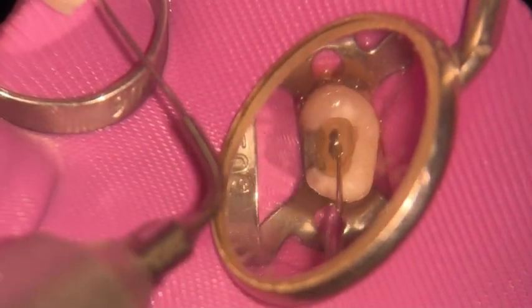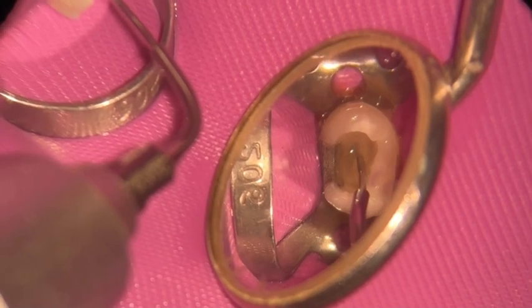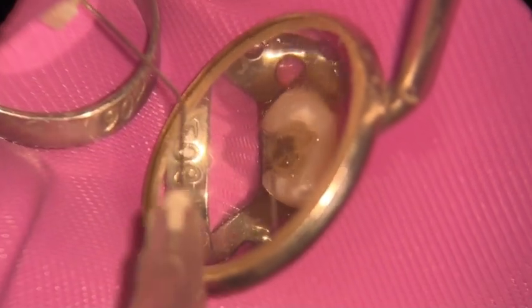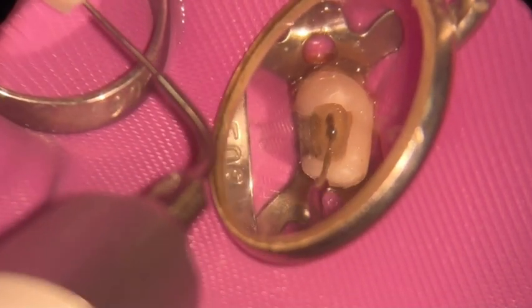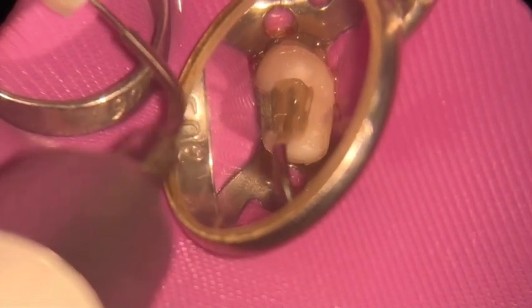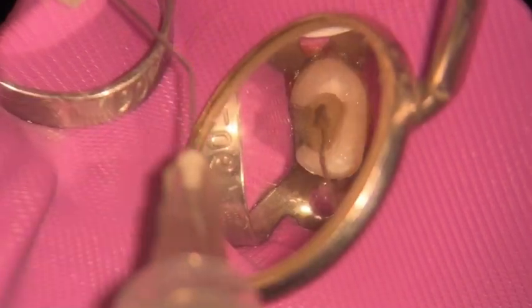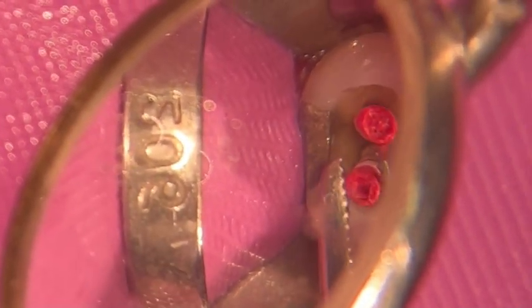We're going to do some ultrasonic activation now. Just be very, very careful with ultrasonics because they can prepare your root canal and they can also break. You don't want to be at this stage and have to deal with a broken ultrasonic tip. I also enjoy sonic activation on curved canals where I cannot get my ultrasonics all the way to a few millimeters from the working length — in those cases I will use sonic activation instead.